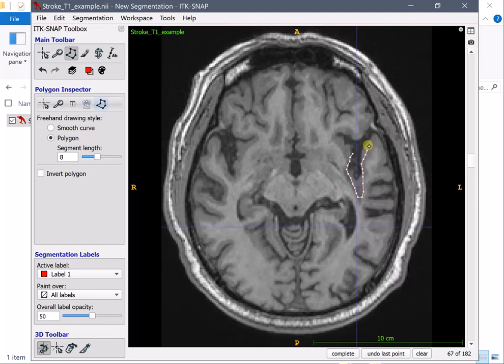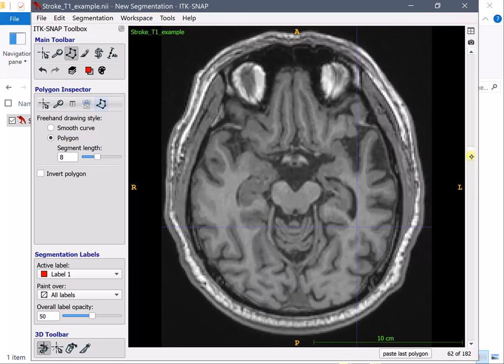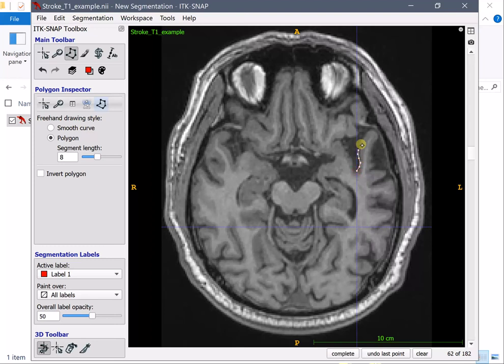Now when you draw in this way it's important that you label from the very top slice to the very bottom slice. And why is that?